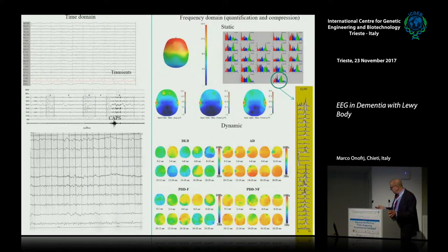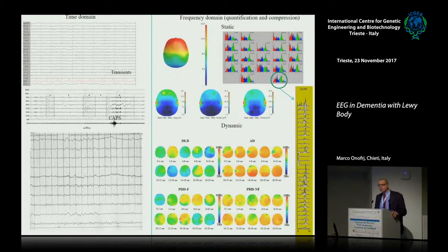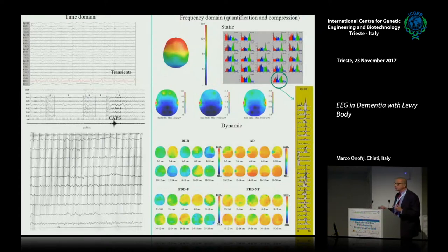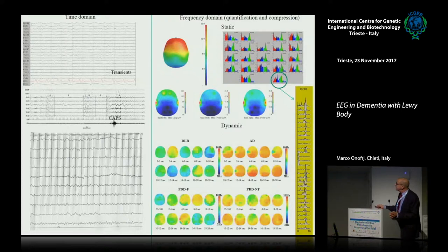Since it is quite difficult to interpret cinematic maps of EEG frequencies, another method was developed mostly to study sleep organization of patients in coma, or the evolution of EEG frequencies in developing brains. By selecting epochs - that is, defined parts of the duration of the EEG recording - you can see through time, every six, eight, or two seconds, how the dominant frequency changes.